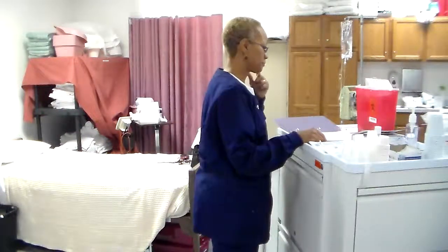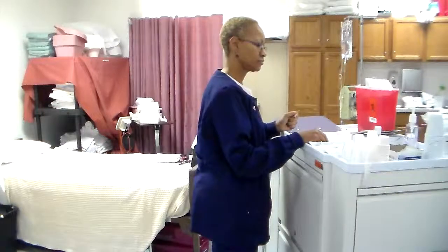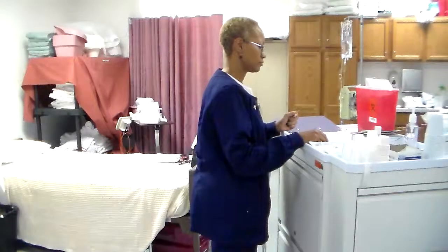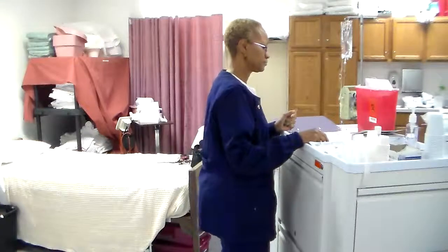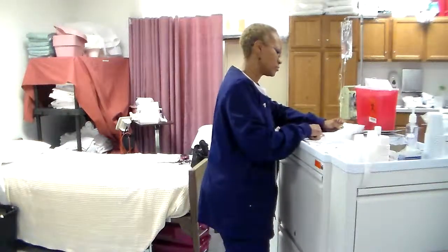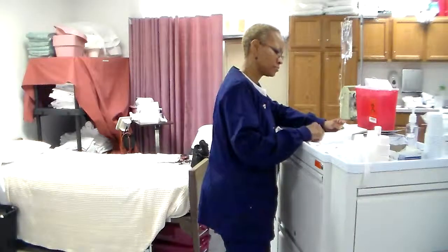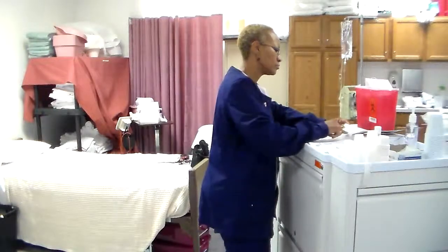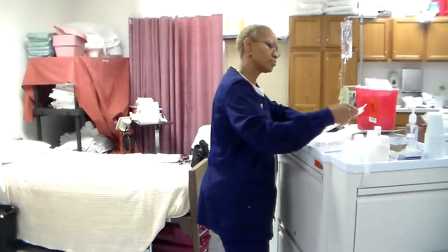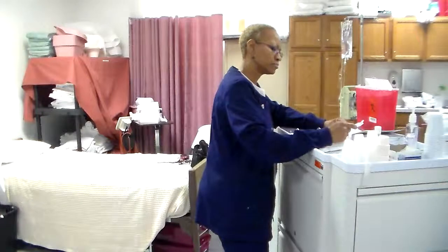5.1, administering intravenous medications by piggyback, intermittent intravenous infusion sets, and mini infusion pumps. Check accuracy and completeness of each medication administration record or computer printout with the prescriber's original medication order. Check client's name and medication name, dosage, route, and time for administration. Recopy or reprint any portion of the MAR that is difficult to read.